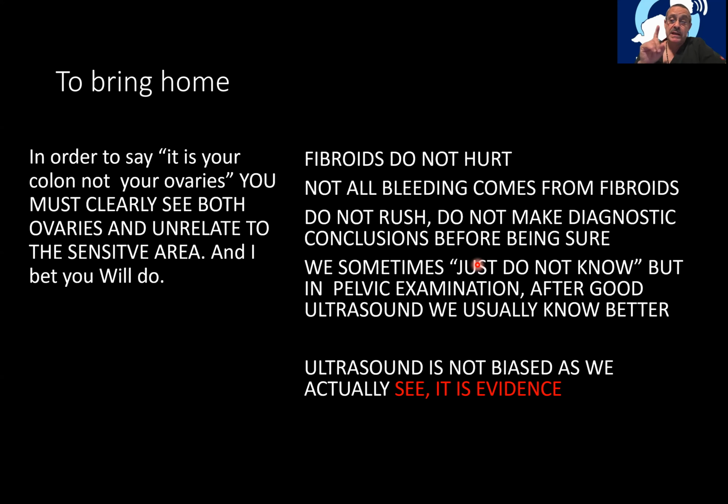But in order to say that's your colon, not your ovaries, you must clearly see both ovaries and unrelate that to the sensitive area. And I bet you will do. Just don't press too much. They will kick you.